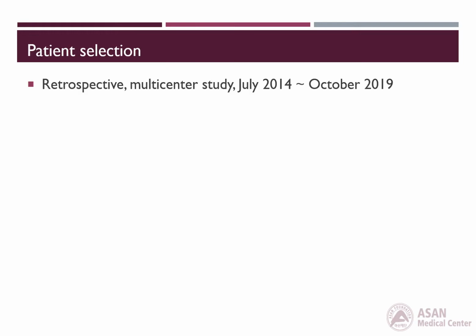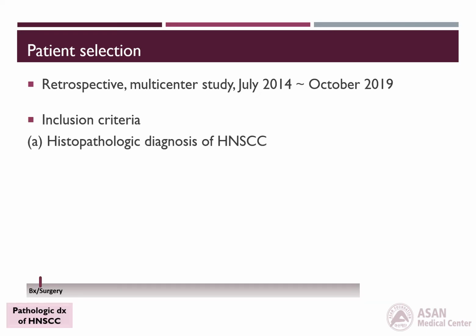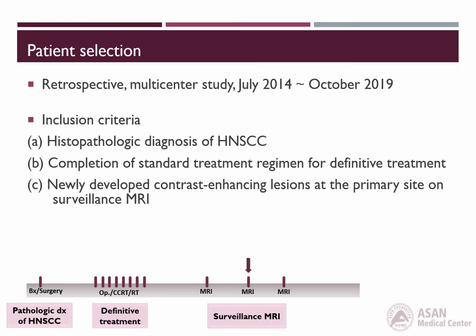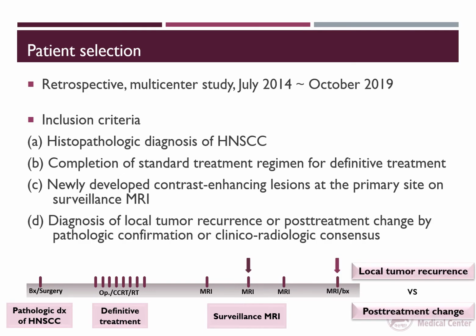This was a retrospective multi-center study from July 2014 to October 2019. Patients with histopathologic diagnosis of head and neck squamous cell carcinoma who completed a standard treatment regimen for definitive treatment, who on surveillance MRI developed a contrast-enhancing lesion at the primary site, and whose diagnosis of either local tumor recurrence or post-treatment change was made by pathologic confirmation or clinical radiologic consensus.